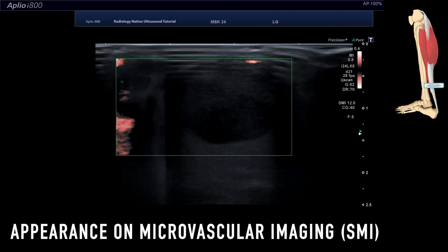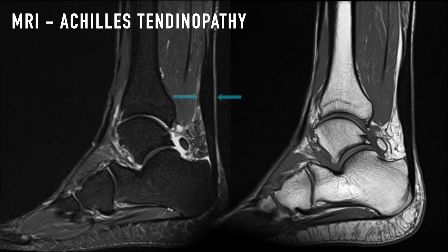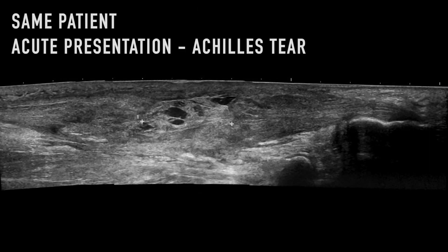Here are a few more examples of Achilles tendon pathology. These sagittal MRI images show thickening of the Achilles tendon in keeping with Achilles tendinopathy. The same patient subsequently presented acutely with pain in the posterior lower leg. Urgent ultrasound showed discontinuity of the Achilles tendon with a central area of mixed echogenicity material. Note the thickening of the tendon in keeping with the prior tendinopathy seen on MRI.